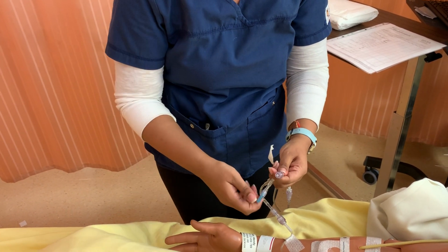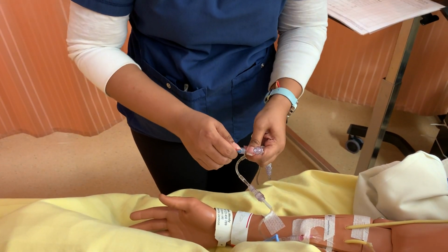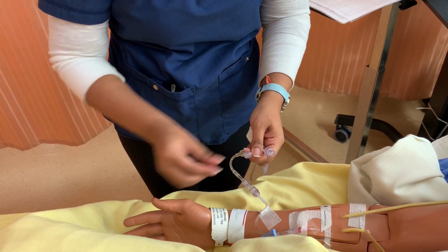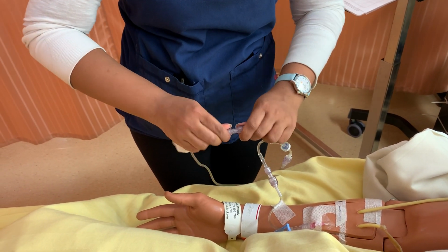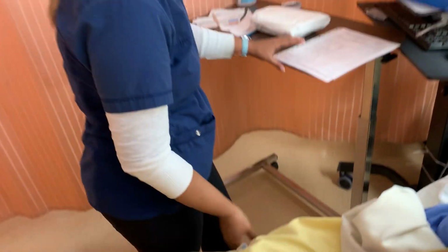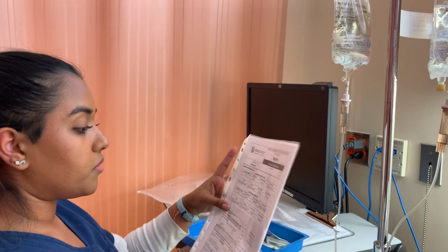Swab for 30 seconds, let it dry for 15. Just going to make sure that stays sterile. We see the bleb of fluid there, so we know it's primed. There we go. Okay, so I'm just going to quickly do another med check, make sure everything is programmed right.